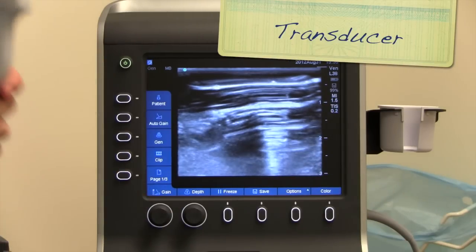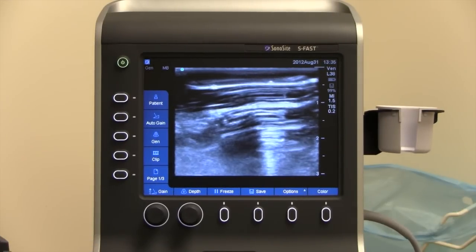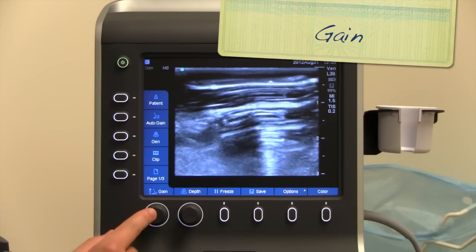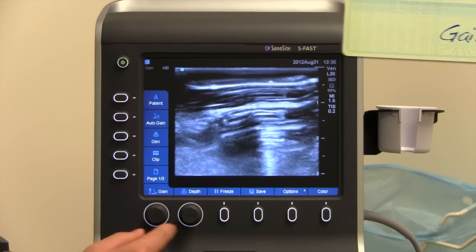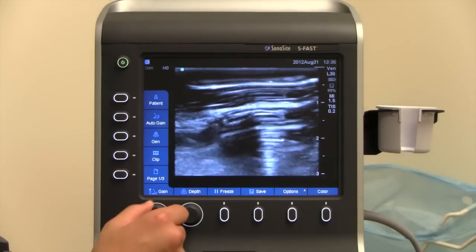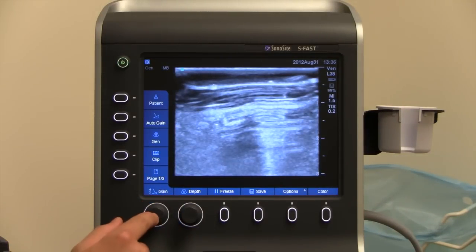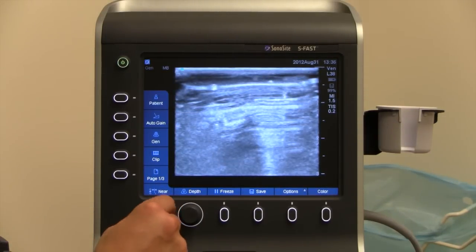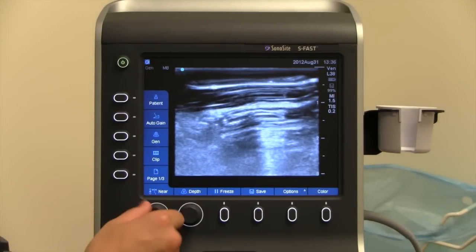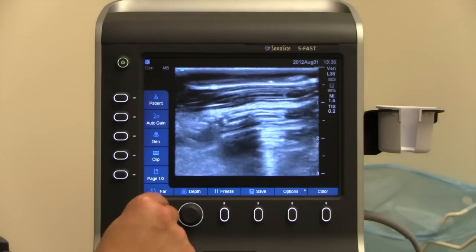The other is going to be the transducers. You can change them from the back — I'd recommend having the instructors change it unless you're really comfortable with exchanging these transducers. The next knob you need to know is the gain button, which we've talked about before. This gain button is all the way in the bottom left-hand corner. By default, it's already on the total gain, so if you turn it, it's going to increase or decrease the brightness of the whole picture. If you push it once, it'll change the brightness on the near-field gain and it'll say 'near' on the bottom. Push it one more time, it'll say 'far,' and that's the far-field gain.